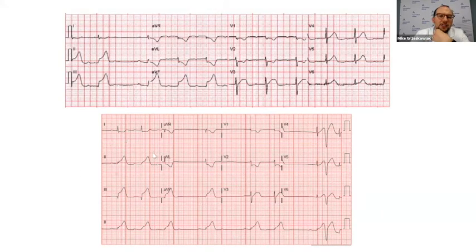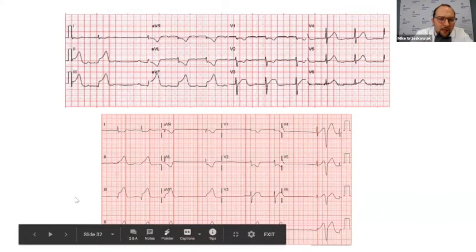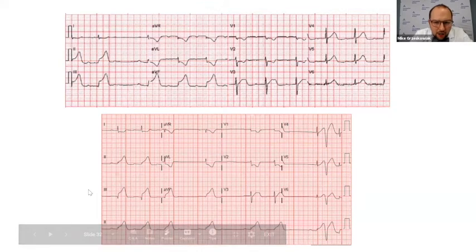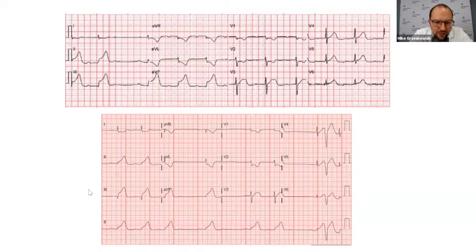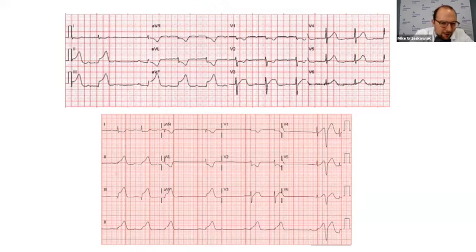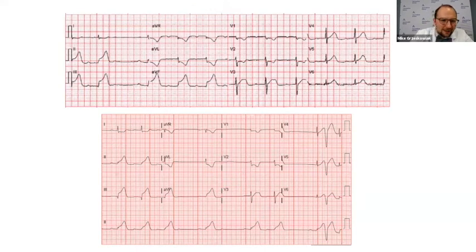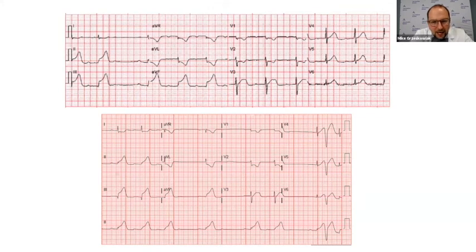Looking at the EKG here that we had in the ED — looking at the rate, he's definitely bradycardic, and his rhythm is irregular. This was basically a second-degree type one heart block.